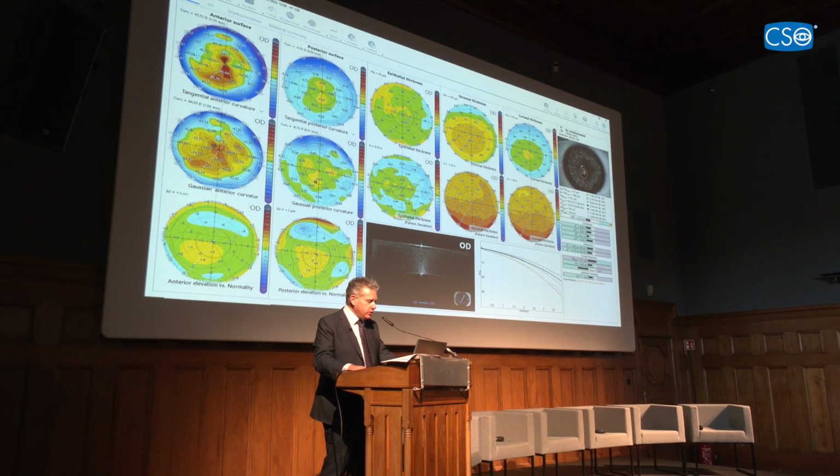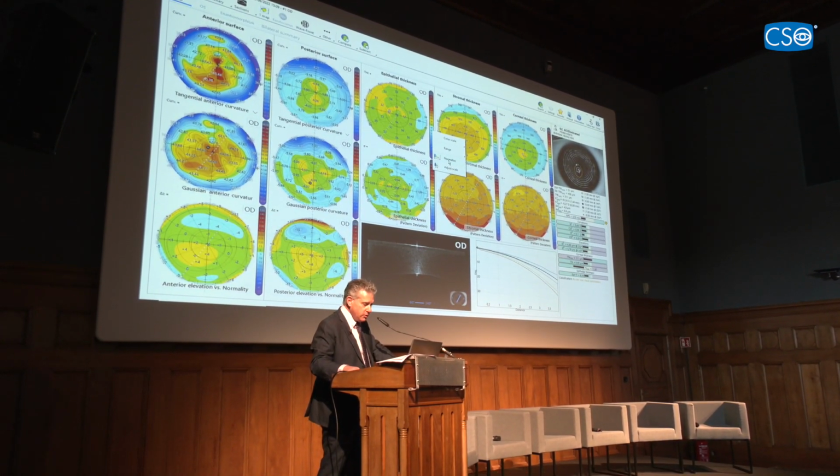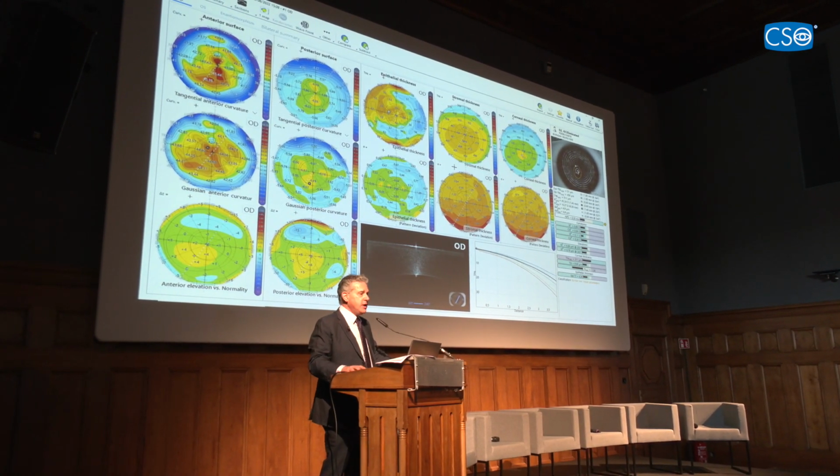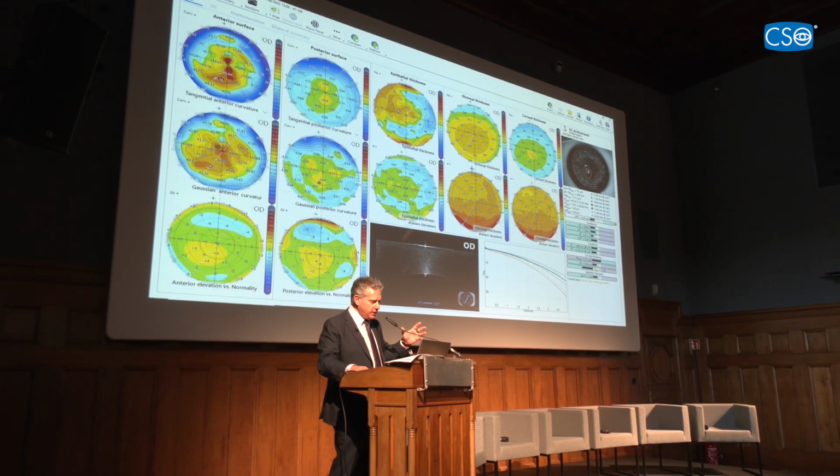Now look how it's all green on the epithelium at the top. And now we're going to normalize the scale. Ooh, Christ, that's totally different. Get it? Always normalize the epithelial scale.